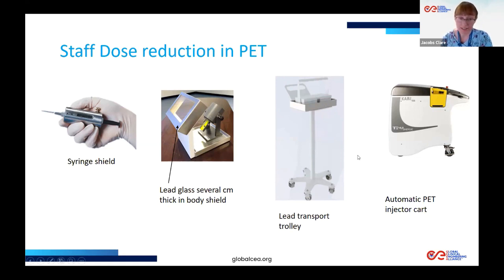In some centres, they have an automatic PET injector cart. This does the whole thing for you in that it dispenses the dose and also injects it into the patient, to try to minimise the radiation dose to staff.